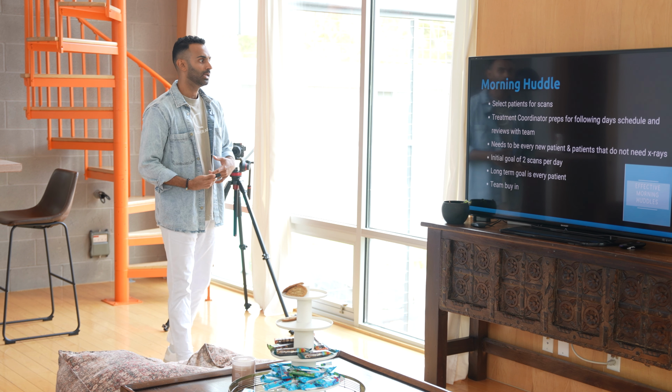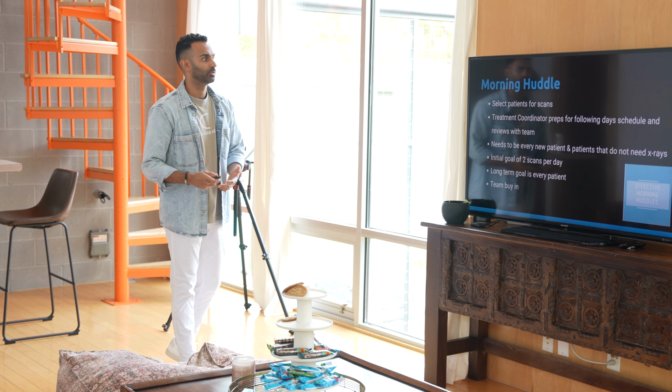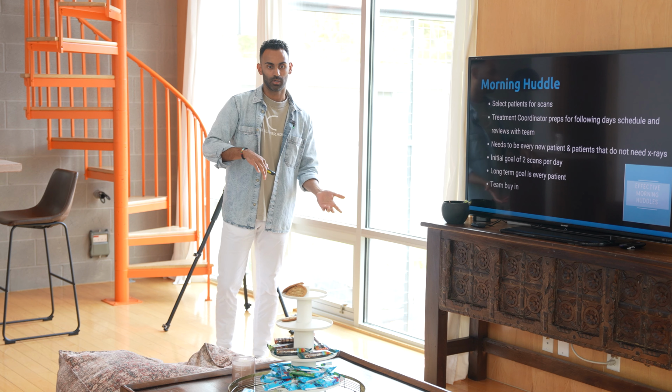And what we also do, especially if you're in the phase where you are starting to implement scans, I know some of you guys are, is this is where you would select which patients are being scanned, okay? And so the goal should be every new patient gets a scan, and every patient that is coming in for a recare exam where they're not getting x-rays gets a scan.